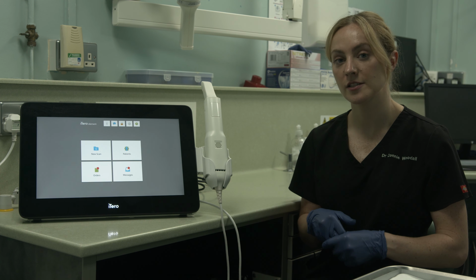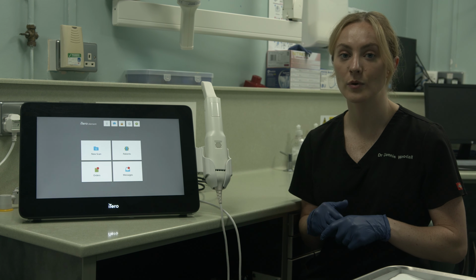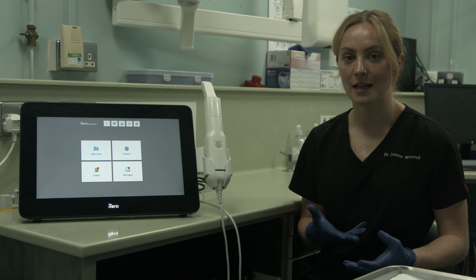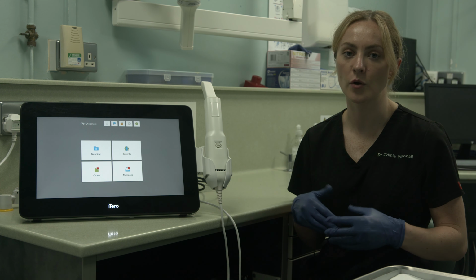I'd also recommend at the start of the day, if you and your nurse go through your day list and see which patients you would need the scanner for, that will enable your nurse to bring the scanner into the room for those particular patients, so there's no waiting around.